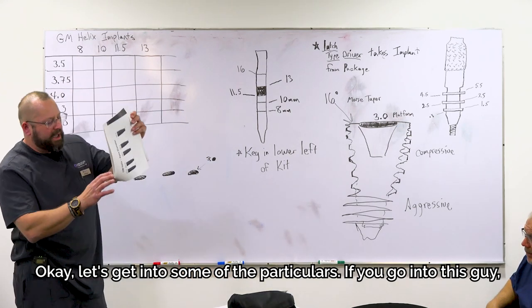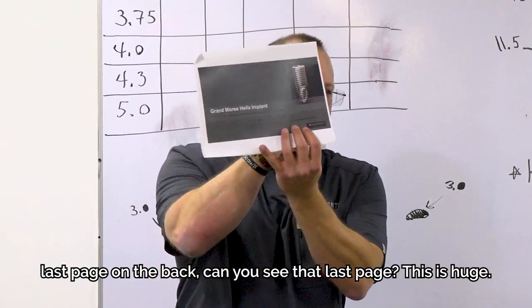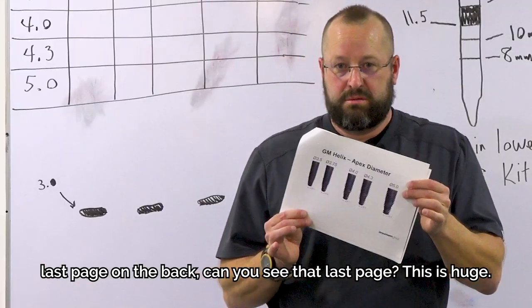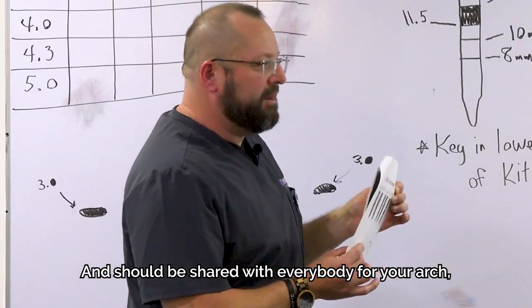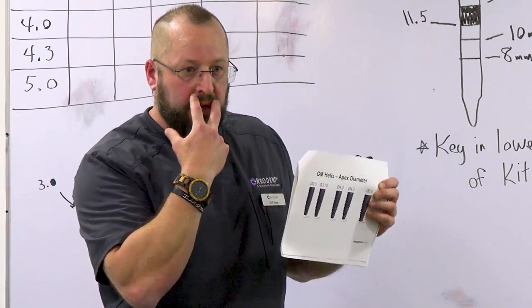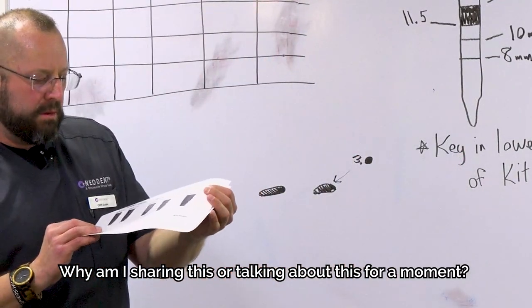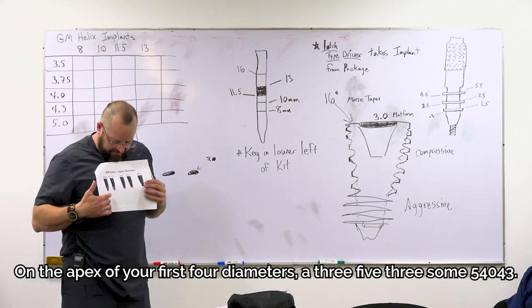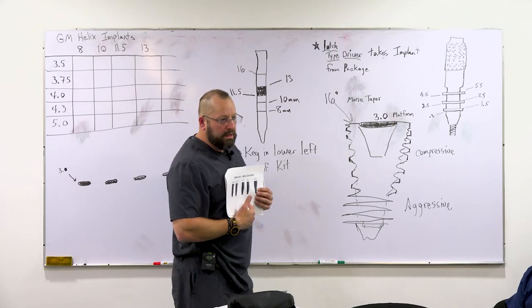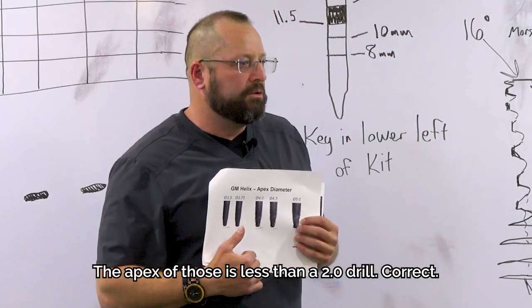If you go into this guy, last page on the back, can you see that? Last page. This is huge and should be shared with everybody for your arch, your full arch patients today, especially uppers. Why am I sharing this or talking about this for a moment? On the apex of your first four diameters, a 3.5, 3.75, 4.0, 4.3, the apex of those is less than a 2.0 drill, correct?